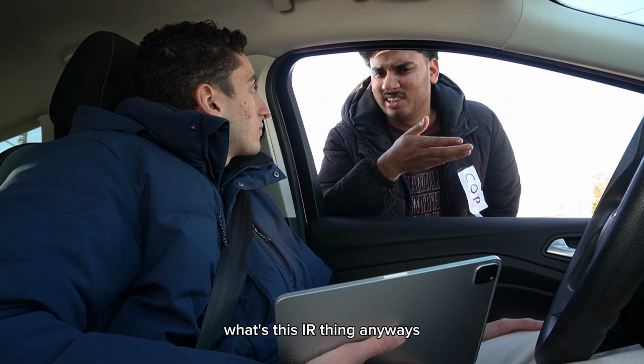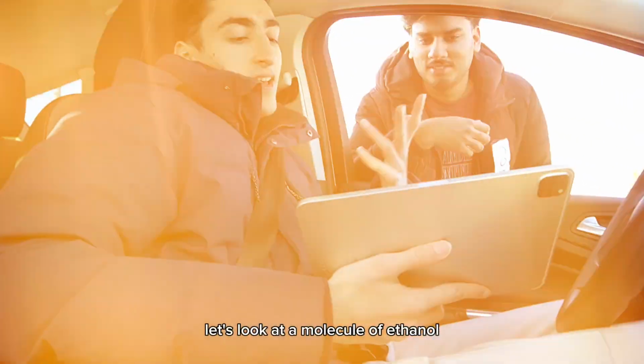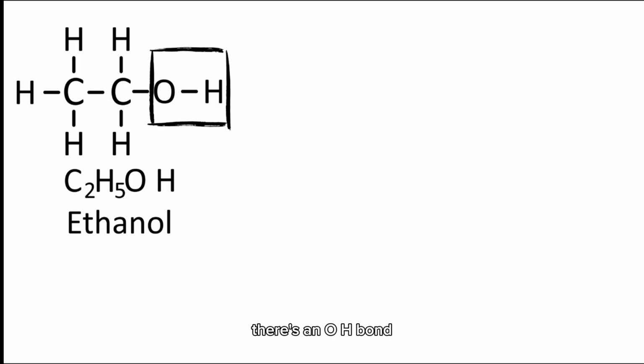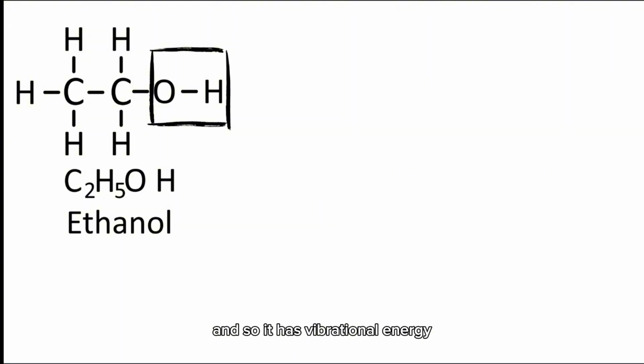IR? What's this IR thing anyways? And how's that supposed to detect ethanol? Well, I'm glad you asked. Let's look at a molecule of ethanol. An ethanol molecule has many different bonds. There are CH bonds, there's a CO bond, there's an OH bond, and each of these bonds is actually vibrating, and so it has vibrational energy.